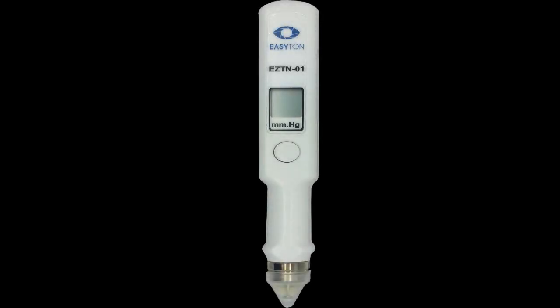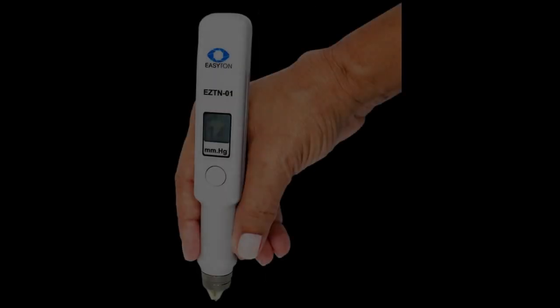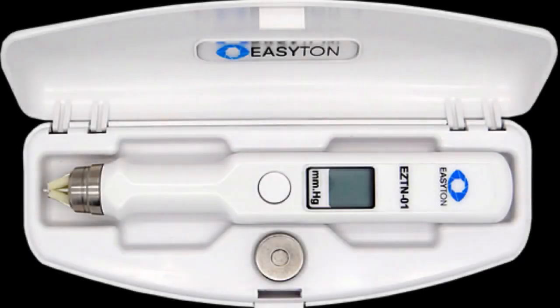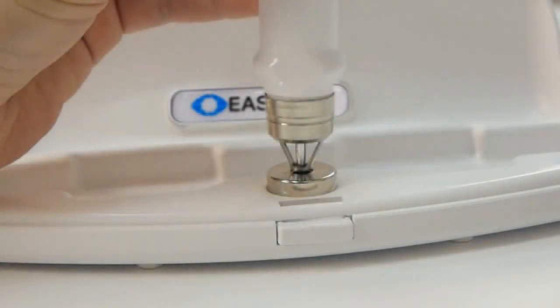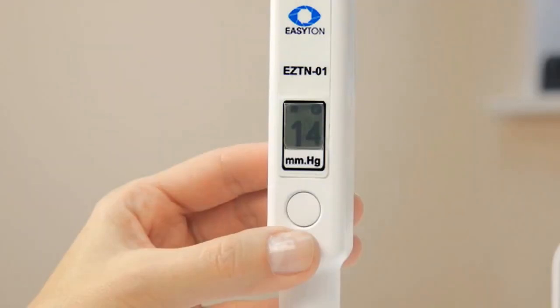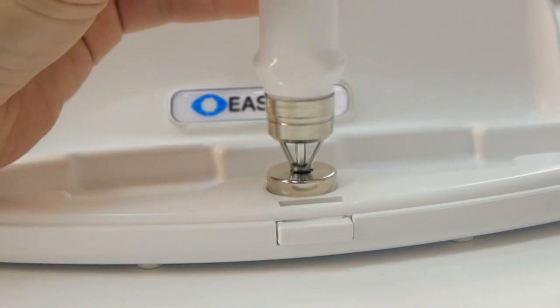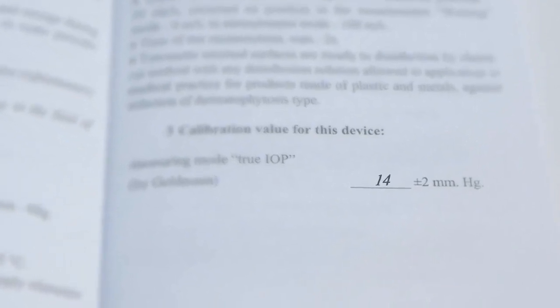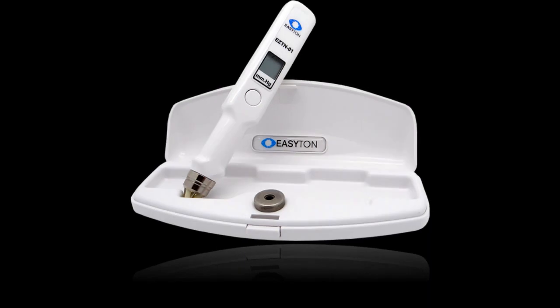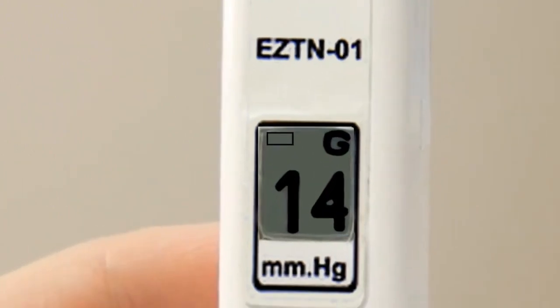Maintenance: do a routine inspection daily and check the tonometer functionality before each measurement of intraocular pressure. Check the tonometer functionality at least once a week using the tester. Checkups are also needed after long work breaks, after dropping the device, and in any other cases when you doubt if it is still operational. To do this checkup, gently insert the device tip all the way down into the tester. Three measurements should be taken; the deviation from the value specified in the operating manual should not be more than 2 units. Clean the tonometer from dust and dirt when needed. If you see a dead battery symbol on the display, replace the batteries.